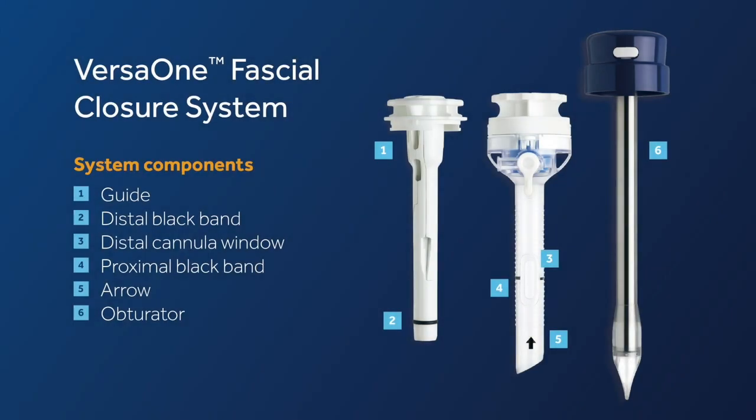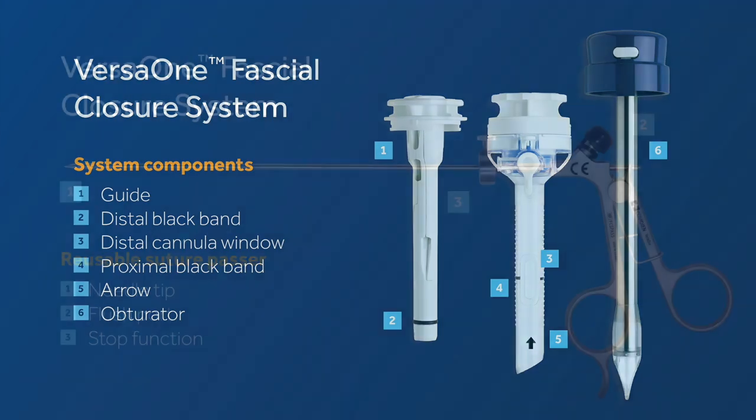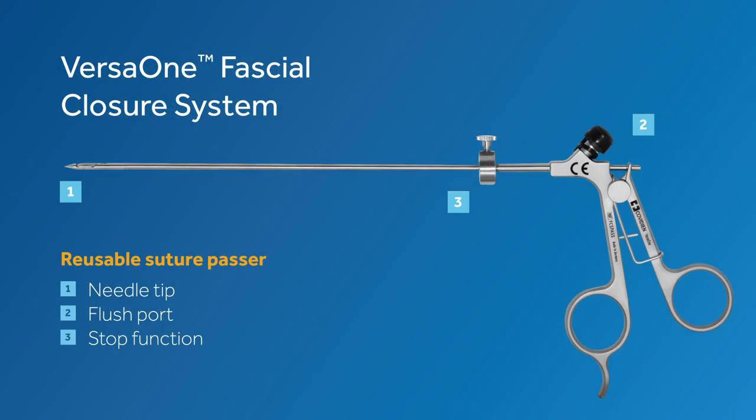Let's take a closer look at the system components. The system is made up of an optical Trocar made with windows to allow passage of a suture passer, and a suture passer guide. The system should be used with a reusable suture passer.